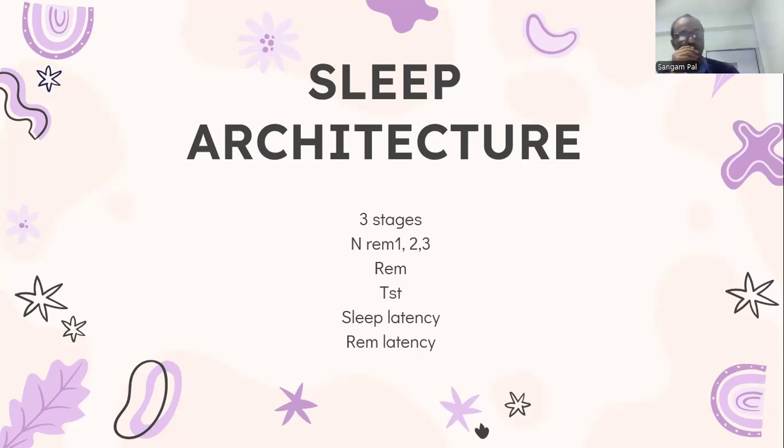When we go to sleep, REM sleep starts after almost 90 to 110 minutes. If REM latency is decreased, it can suggest a patient having narcolepsy, although it is not pathognomonic of this feature. A narcolepsy patient will have cataplexy, that is sudden loss of tone of all limbs at emotional times in the daytime.